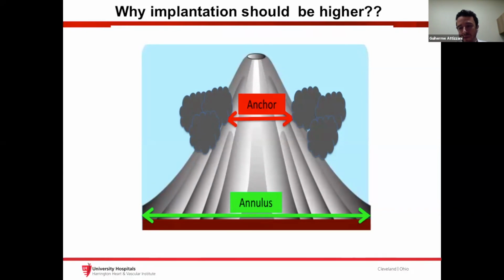Do you do that normally or not? With bicuspids I do. My main concern is that the nose cone catches on the way out if it's really pancaked. But Steve has a lot more experience with CoreValve than I do, so I don't know. What do you do, Steve?